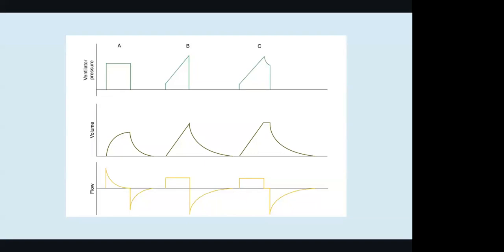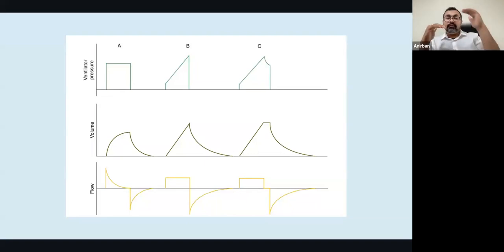So let's continue. In a pressure control ventilation, you have set the inspiratory pressure and the PEEP. Now the patient is in active bronchospasm, severe bronchospasm. He is generating only a tidal volume of 200 ml. You have given bronchodilators, and the patient's bronchospasm is resolving. For the same set of inspiratory pressure and PEEP, the patient will now be able to generate a 500 ml tidal volume. So the tidal volume varies in a pressure controlled breath.